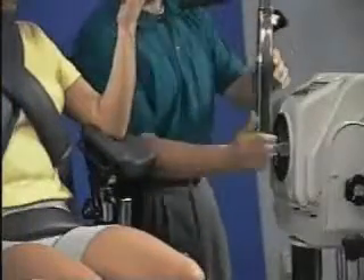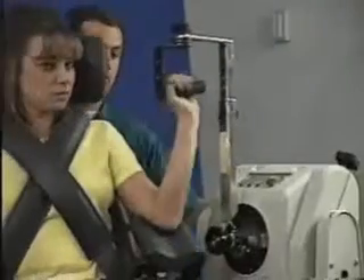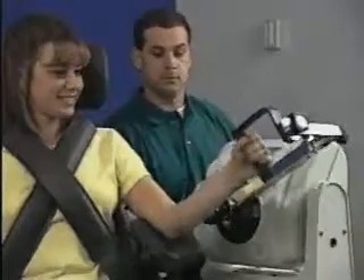Using the red dots, align the elbow shoulder attachment and secure it. Move patient into position, check axis of rotation, and set range of motion limits.